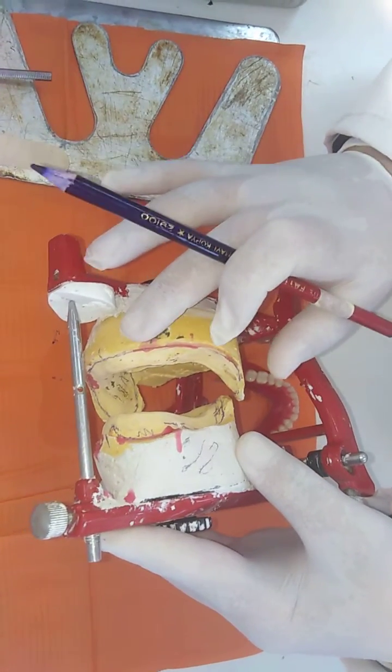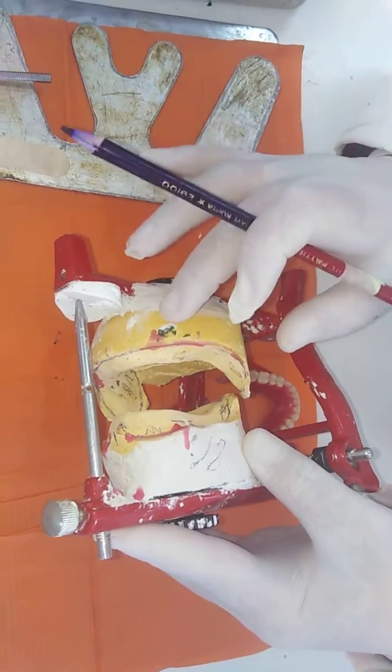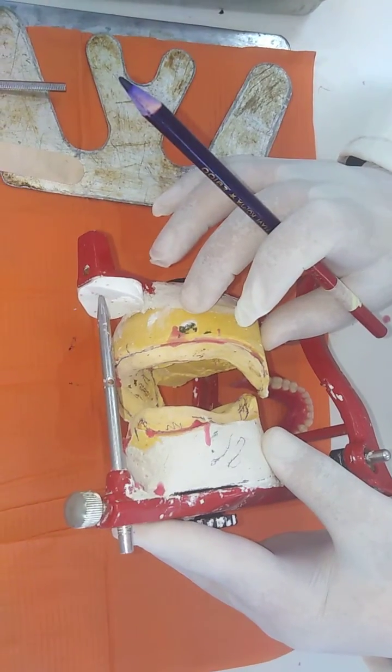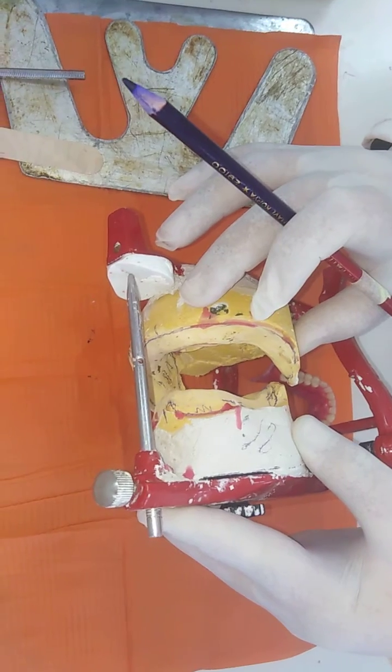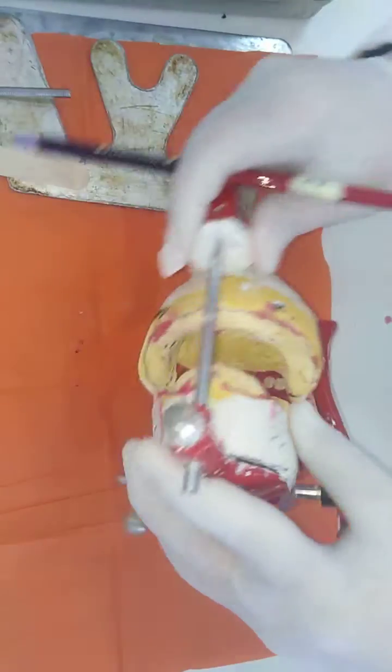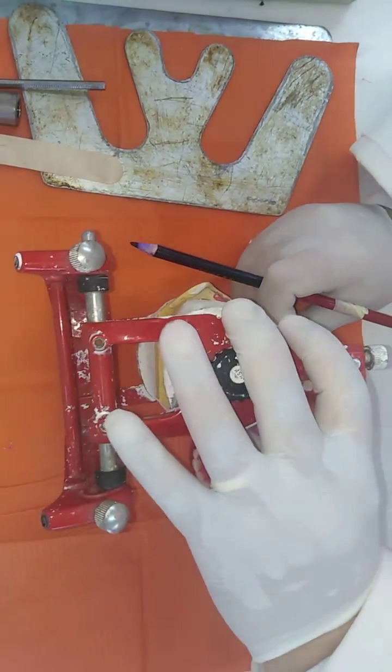This is a bit more severe than another video that I've recorded for class 3. We talked about incisal camouflage and slightly about the molar camouflage, but there only incisal camouflage was done. Today we're going to talk about molar camouflage. So why is class 3 a problem?